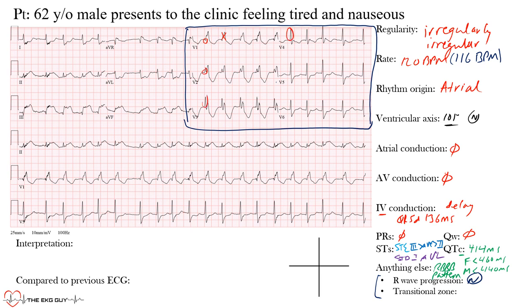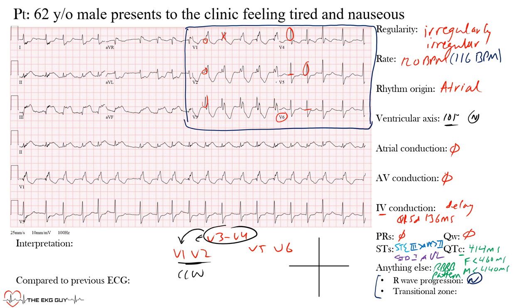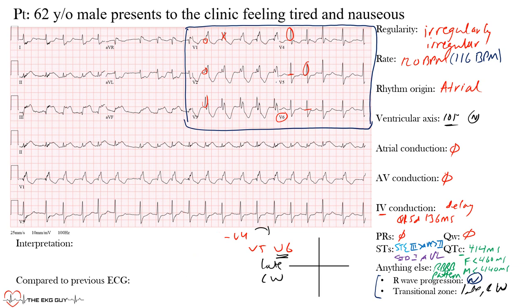For the transitional zone, we're looking for where the complexes go from mostly negative to mostly positive across V1 to V6. Focusing on the initial portion — to avoid being misled by the terminal RBBB deflection — the complexes appear mostly positive through most leads, with the transition appearing around V6, making it the most isoelectric lead. Normal transition is between V3 and V4, so this represents a late or clockwise transition.